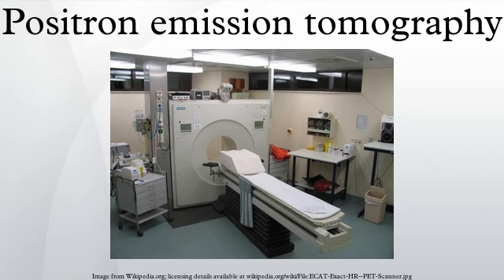Radionuclides and Radiotracers. Radionuclides used in PET scanning are typically isotopes with short half-lives such as carbon-11, nitrogen-13, oxygen-15, fluorine-18, or rubidium-82, 1.27 minutes. These radionuclides are incorporated either into compounds normally used by the body such as glucose, water, or ammonia, or into molecules that bind to receptors or other sites of drug action. Such labeled compounds are known as radiotracers.